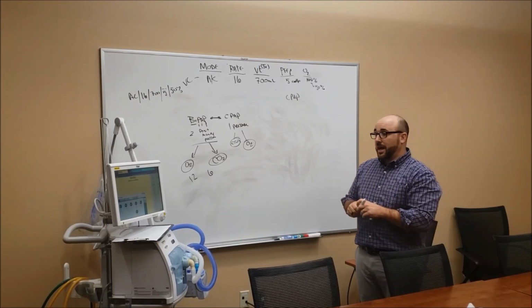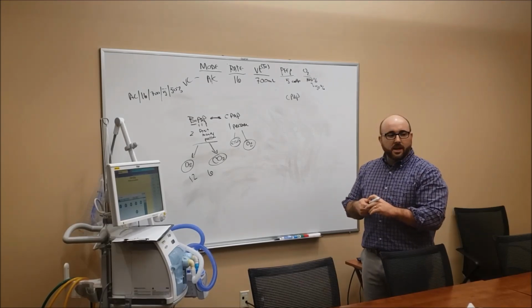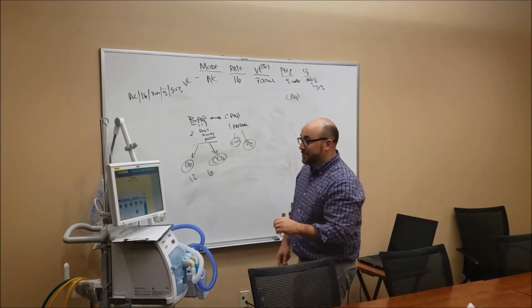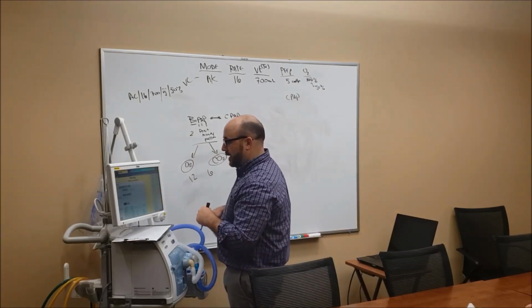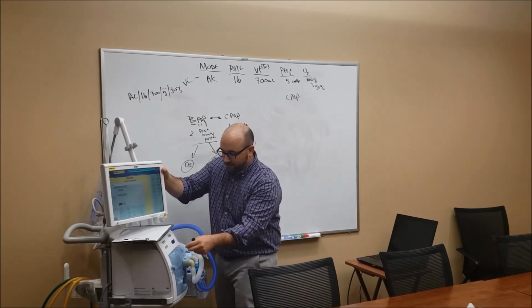So I can show you something. You can suction down here, right? Yeah, inline suction. You don't have to have respiratory suction. No, we don't. So there is a cool button on here, and if I hook this up to air and oxygen, I can show you. But this button right here, let me pull a little closer.